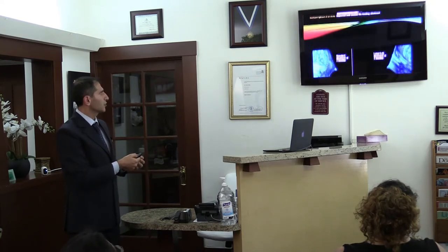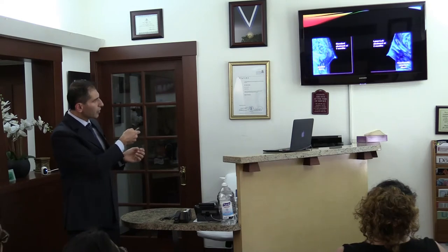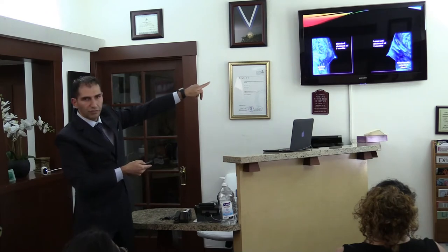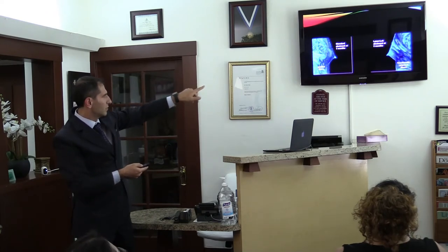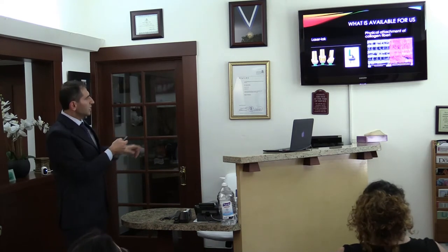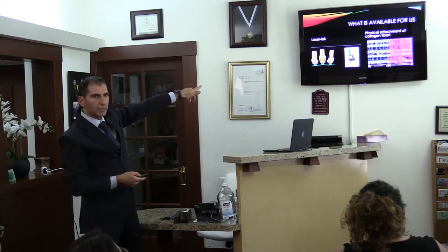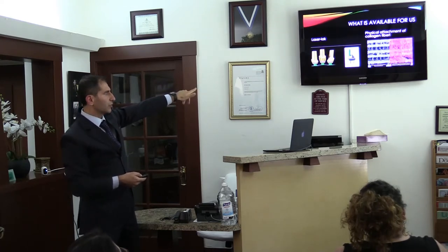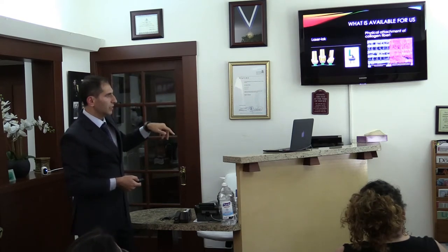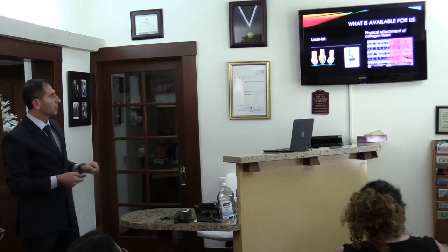So this is, again, a histological study. I like this slide because you can see the difference between the parallel fibers and the functionally oriented fibers. And you can see these are microgrooves. You can see the laser ablated surface, that gray surface on the abutment. That's rough, that's 8 micron. But you can see here's the collagen fiber insertion into that laser lock, or laser ablated, microchannel.